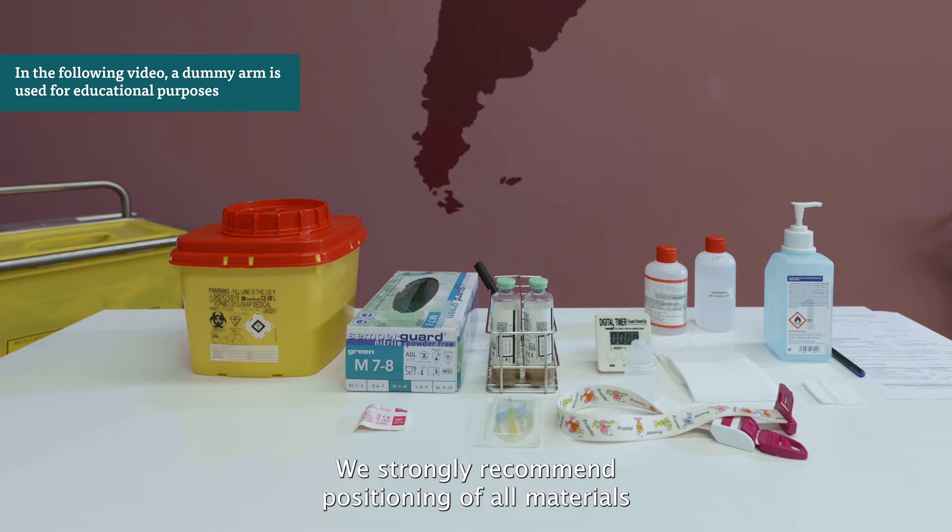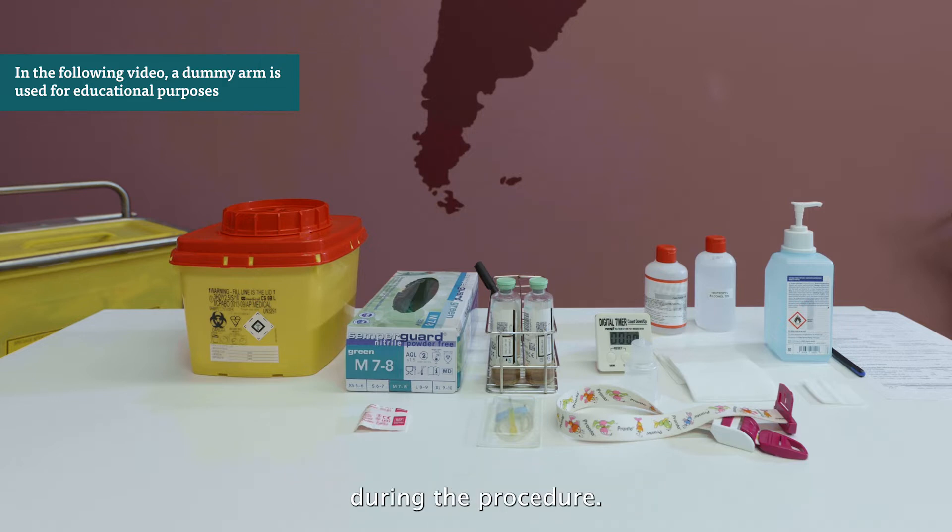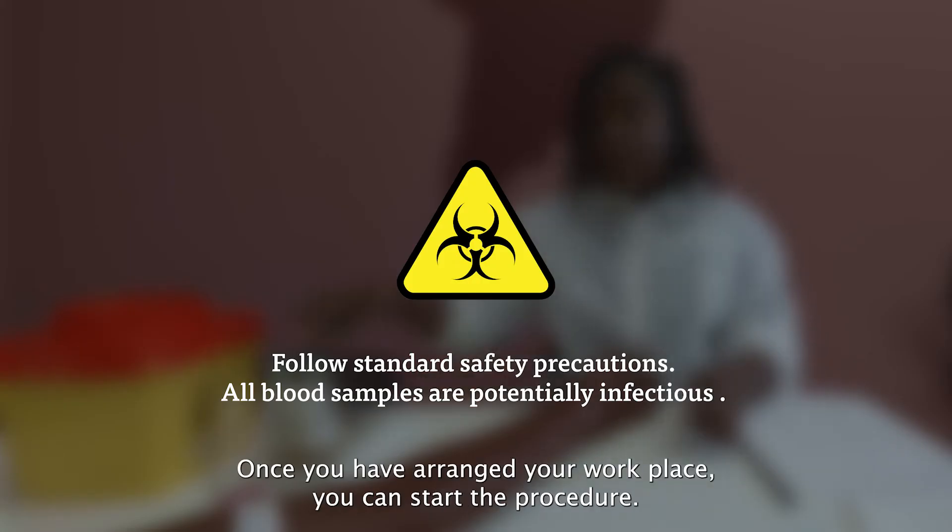We strongly recommend positioning all materials at the side of the dominant hand to avoid crossover of the arms during the procedure. Once you have arranged your workplace, you can start the procedure.